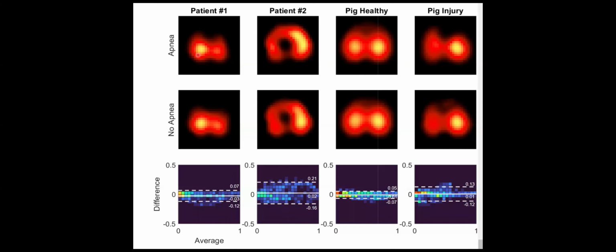Here, the image is with a pause, so performing an expiratory pause, and here without performing any pause. So very similar images in both cases. We believe that this is going to be the future. So we are going to analyze the perfusion without using any expiratory pause, despite the fact that the pause is not dangerous per se.